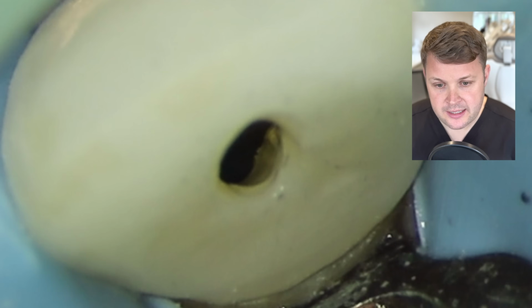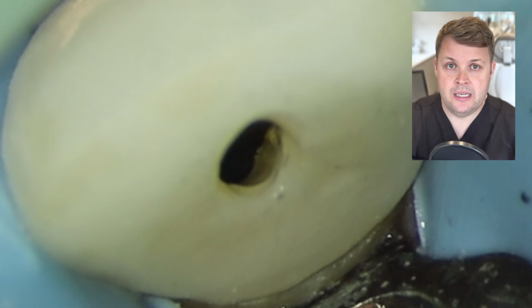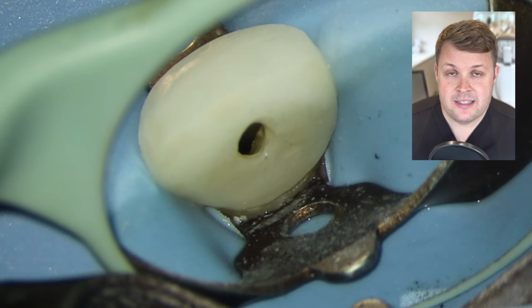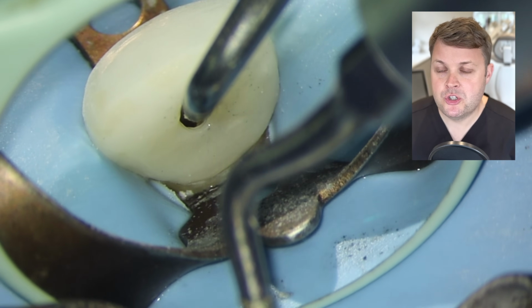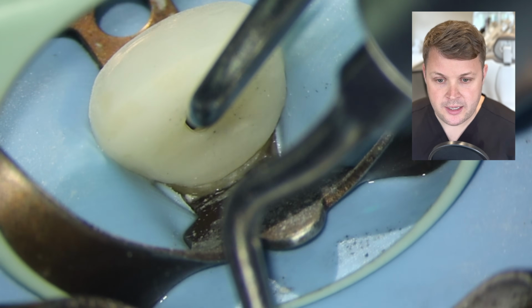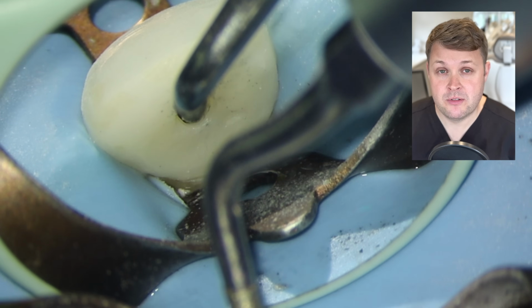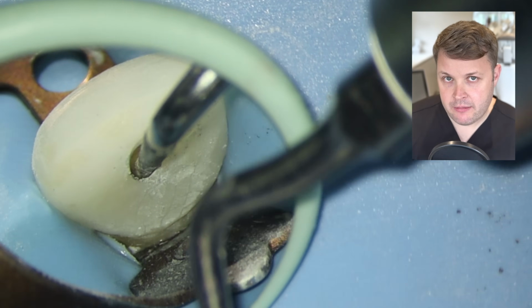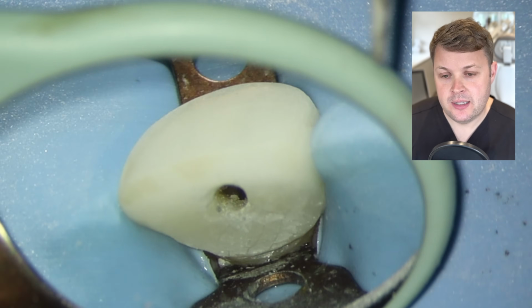But we can see there's a little bit of a ledge here, and this is the transition between the lingual shelf and the pulp horns. And this again will be difficult to obturate right at the end. The irrigant will flow down there, but once you try to obturate the coronal aspect of this tooth and then fill it with a restorative material, say like flowable bulk composite, it might be a space where bacteria can proliferate.